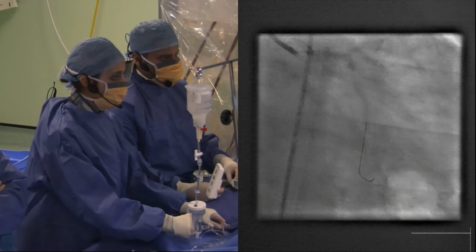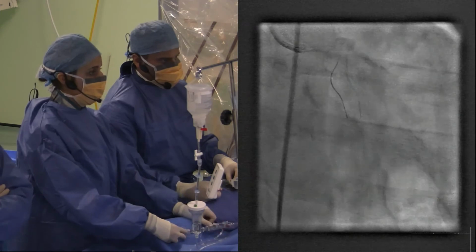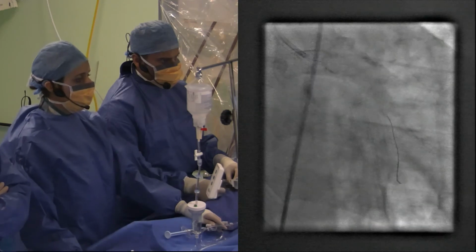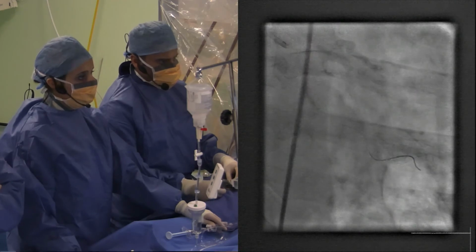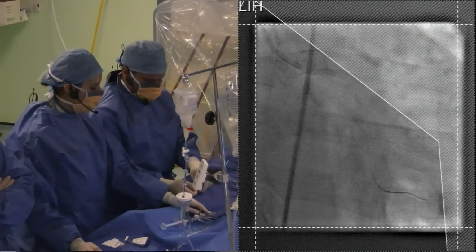So I'm always very, very cautious wherever we make physiology measurements to make sure that we make the best possible physiology measurements, and we always like to make sure that we're making a measurement which, wherever possible, is free from pressure drift, free from any problems that we may be causing as doctors to not make a very good measurement. And so if you ever see anything which concerns you, it only takes a few seconds to make a drift check, to normalise once again, and then to repeat our measurements.